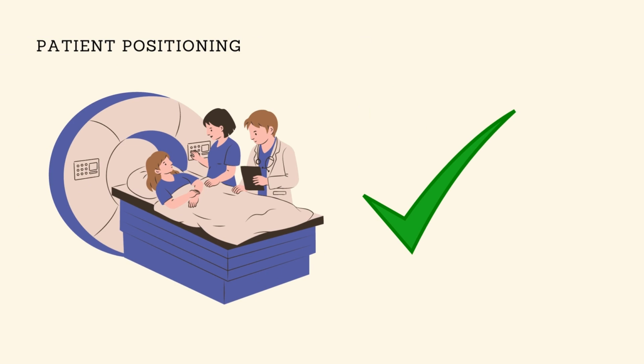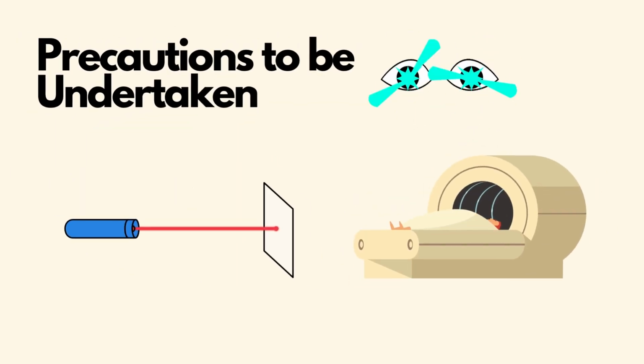Positioning of the patient can affect the safety of the scan procedure. Improper positioning can result in sunburn-like burns. In order to maintain a safer scan environment, the following precautions are to be taken. MRI systems are equipped with laser alignment lights. Exposing eyes to the laser alignment lights may result in eye injury. Do not stare directly into the laser beam.